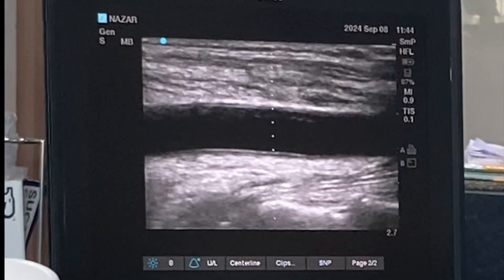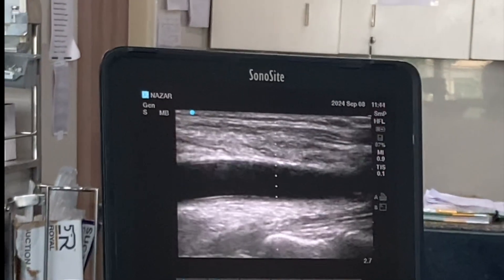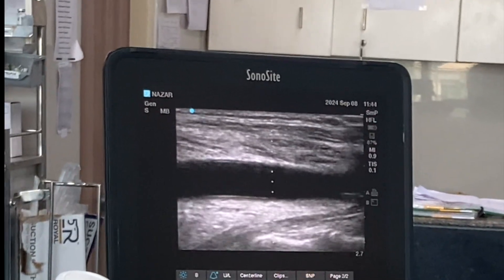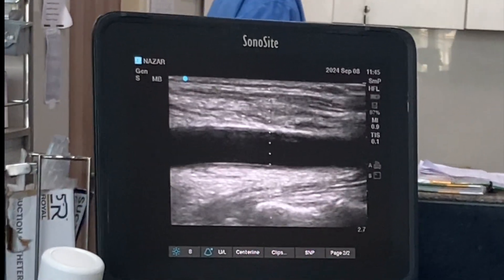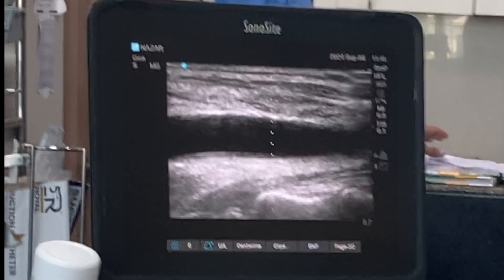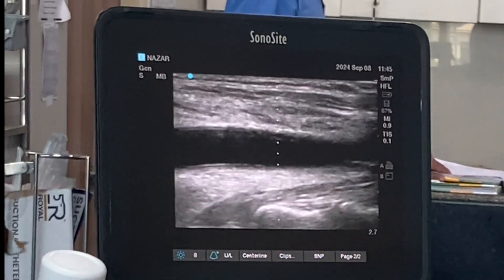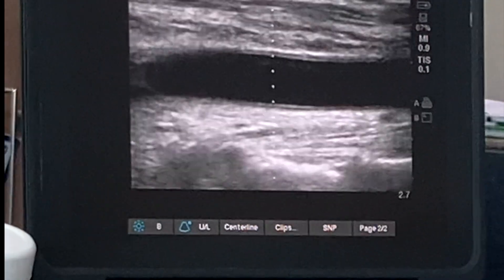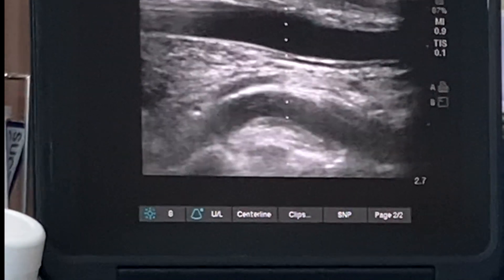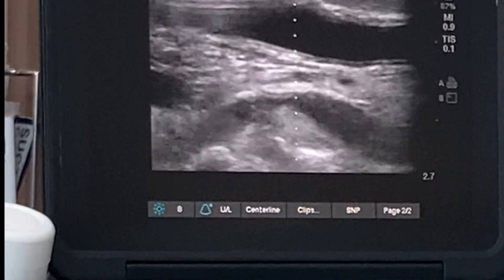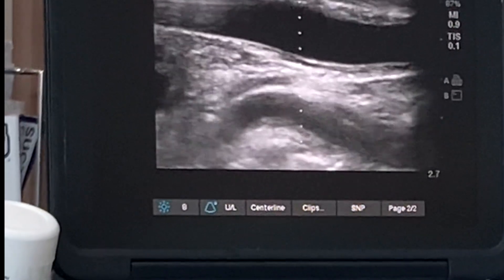I have also looked for the carotid artery. This is the carotid artery — this is the non-pulsating structure and this is the pulsating structure.